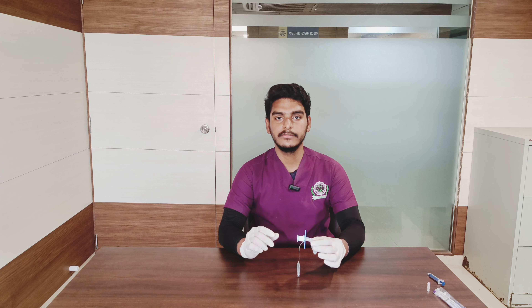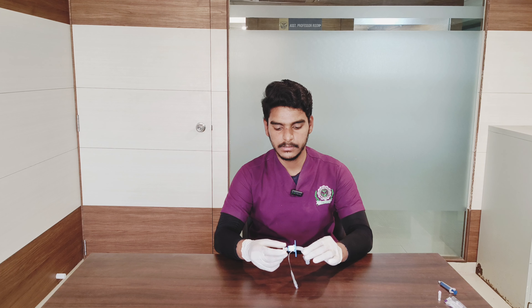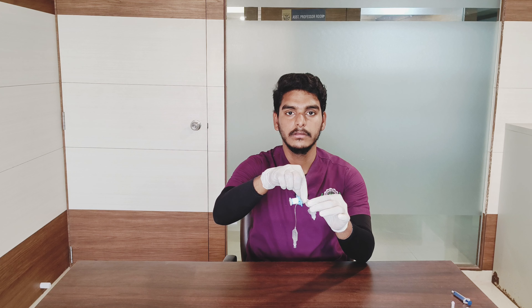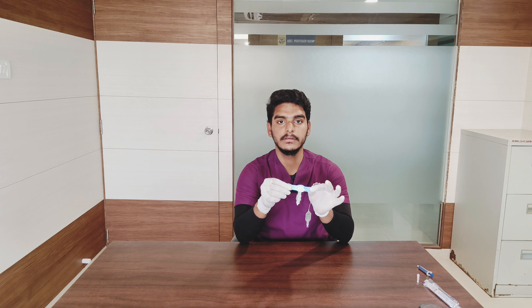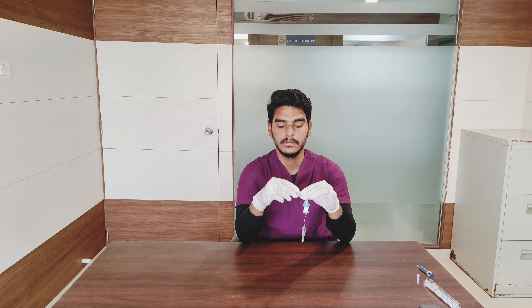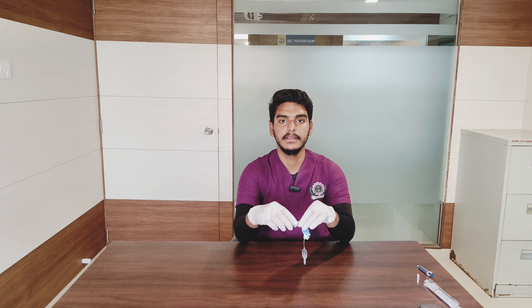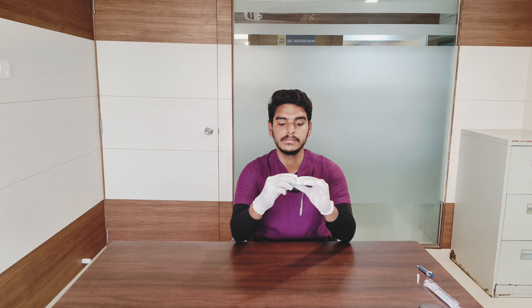Explaining the parts of the tracheostomy tube: it has a connector, an obturator inside the tube, an outer cannula, and an inner cannula. There is a neck plate through which it is inserted — the neck plate keeps the tracheostomy tube in its place after it is inserted through the hole. There is also a cuff like the one on the endotracheal tube; air is injected through the pilot balloon to inflate the cuff and keep the tracheostomy tube in position.